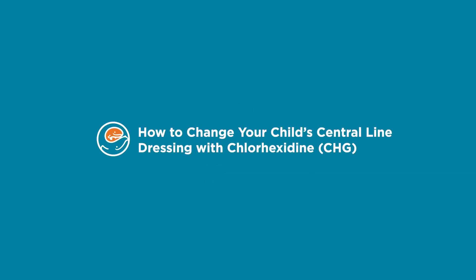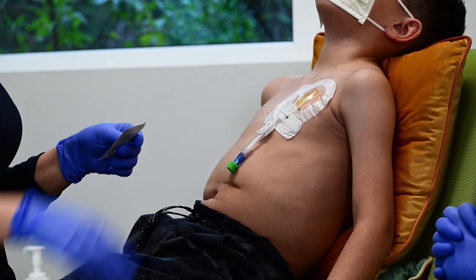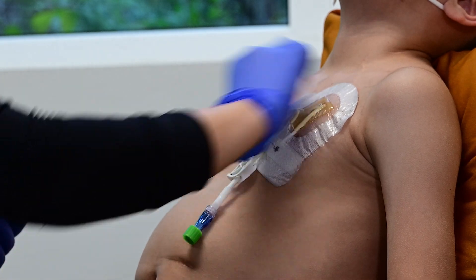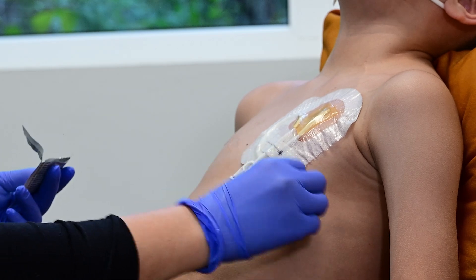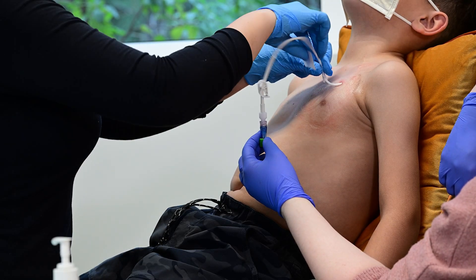How to change your child's central line dressing with chlorhexidine, also known as CHG. This video will show you how to change the dressing on your child's central line, including the standard dressing with CHG products. While this may seem intimidating at first, we have confidence that with continued review of this video and practice with your care team, you will feel ready to do this with your child.